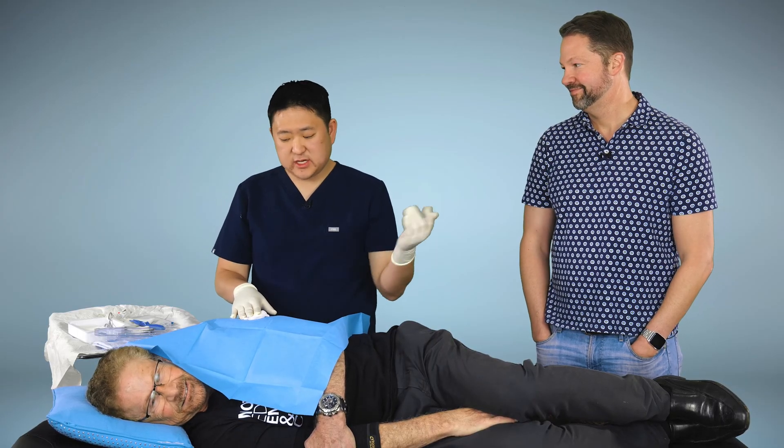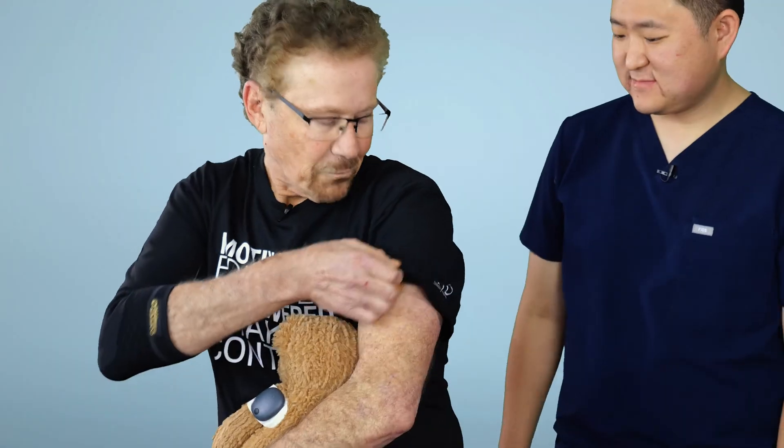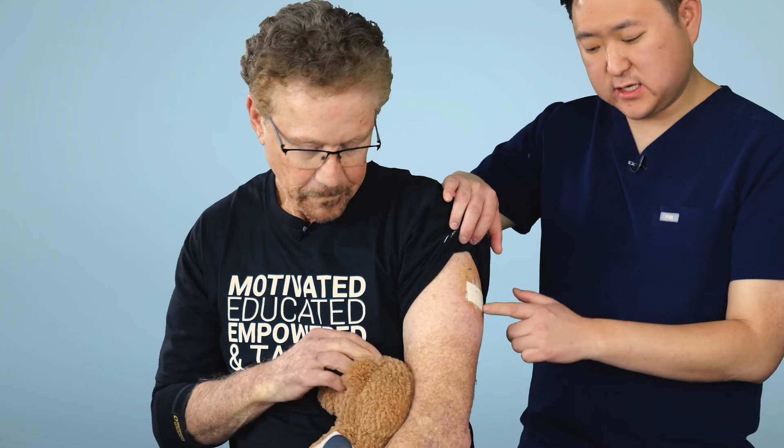Really any endocrinologist, physician, NP, or PA can be trained to do this — it's very easy. Steve, how did it go? It went really well; I really couldn't believe how fast you did it. There's a very small bandage and you're going to let that fall off naturally — don't pull it off on your own. For the next five days you just want to make sure you're not having prolonged exposure to water. Showers are totally fine; you just don't want to be sitting in a sauna or hot tub. Tomorrow you will start being able to get readings, and you also get vibratory on-body alerts — that's one of the distinct features of the E3. There's actually a unique pattern for high blood sugar and low blood sugar.